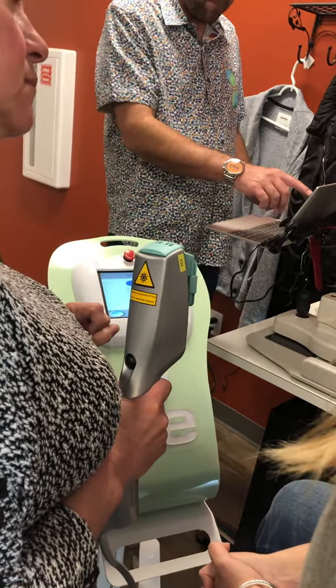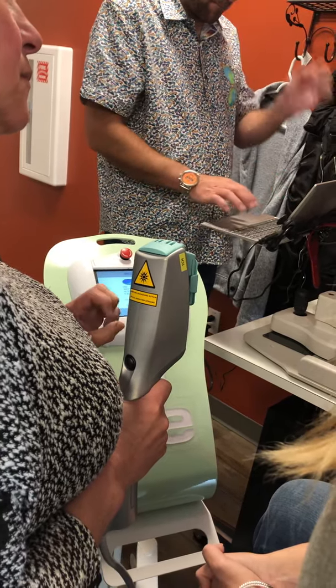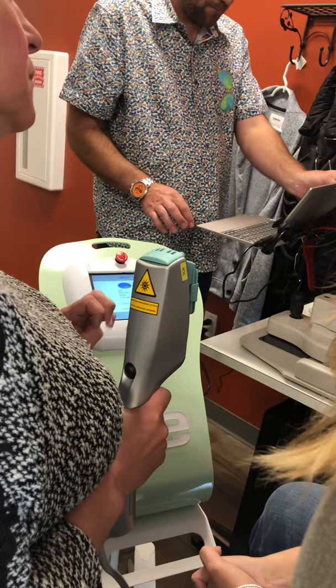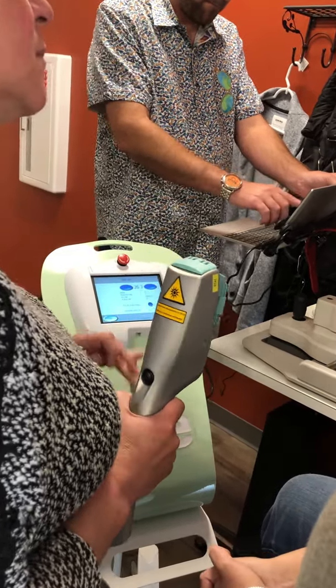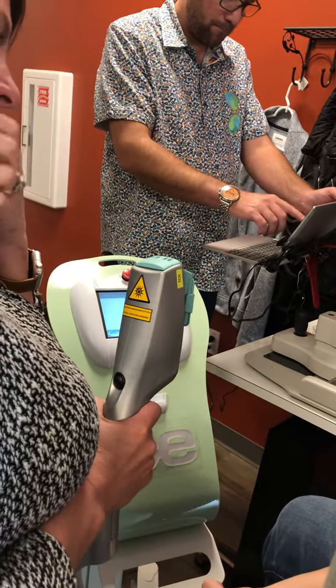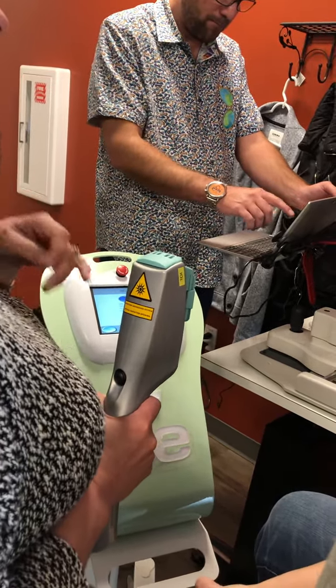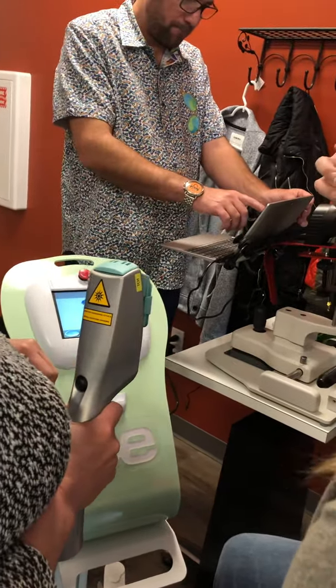And she goes, no. And you treat one here and one here to get rid of the hair. That's now 12. It's still one treatment as long as it was done in one routine. You're just encompassing the whole area. Or if I said, well, okay, do we want to get that dark spot there? Or, if you do the whole face, I was going to say, you might as well do it. You already said it, doing the face, that's a treatment.